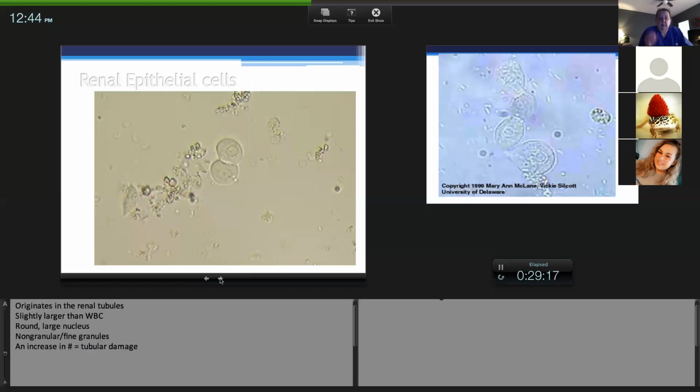Again, I don't want you guys to think that if you see a urine sample with transitional cells, which are the lining of the bladder, that's cancer. If a dog has a straight up UTI, you're going to sometimes see transitional cells. Are those transitional cells malignant? Okay, so transitional cells in a urine does not mean the dog has TCC. Let's just make that clear. It can sometimes be picked up on a urine sample. Now, if a doctor saw that, we would probably do a biopsy or what's called a traumatic catheterization and try to yield sheets of cells and send it to the lab to make sure, or do an ultrasound of the bladder and try to take a biopsy.